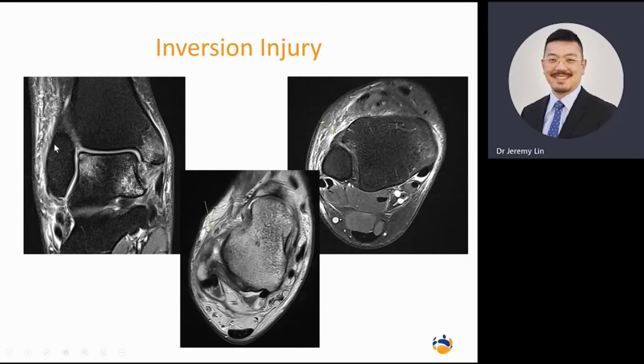In this particular picture I've picked out, you can't actually see the avulsion fracture or edema of the fibular tip, but you can see part of the ATFL near here, and that's edematous again, as I was saying before. So as you can see, with one study, you can get a lot more information, and you can get information on structures that are potentially missed on the other imaging modalities.